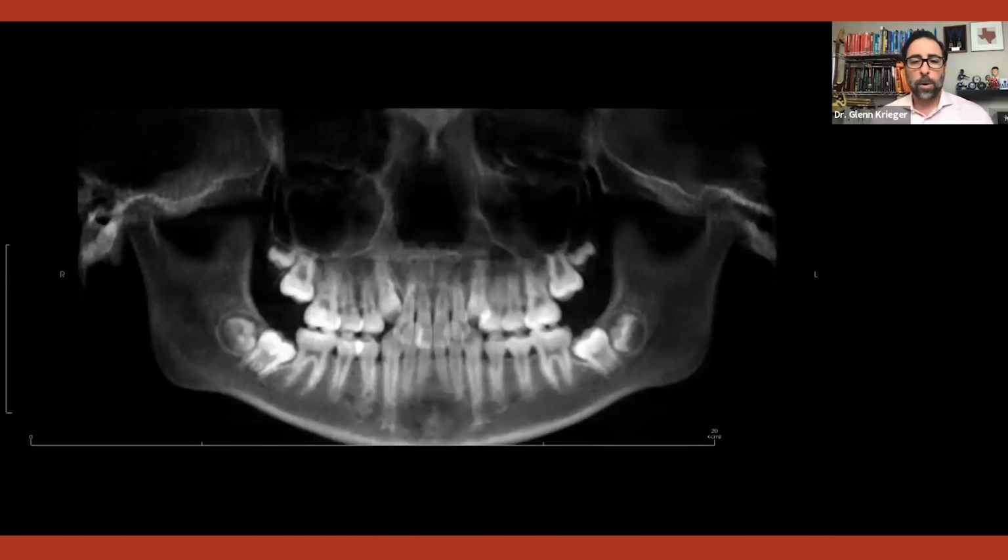Again, my goal here is to show you normal stuff, the things that are going to come in your office, because I am one of those people who's going to tell you I could never imagine going back to treating without a CBCT. It just shows me too much. And that little bit extra of what I need to see is often found in the CBCT on a normal case. So you can look at this case. Does anything jump out to you as being abnormal or strange? Not really. This is a typical bread and butter case in most of our practices, right?